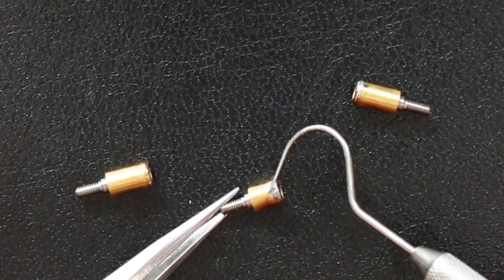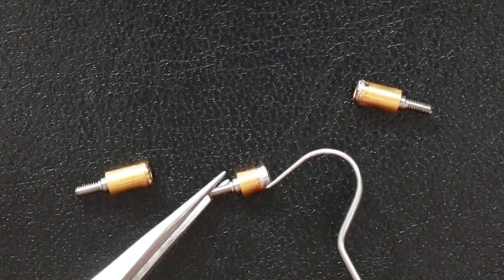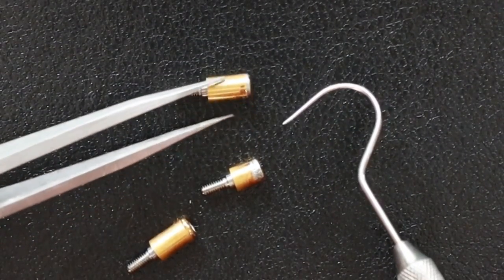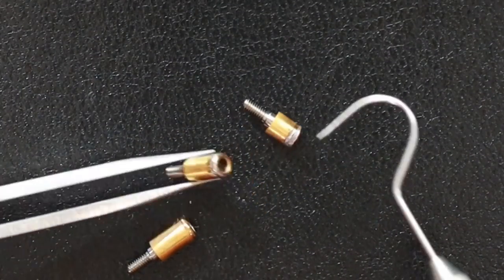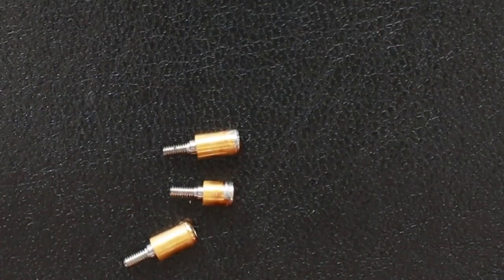When that happens, new snaps won't hold the denture in place anymore, and you will need to have the posts replaced. Here are some implant posts that I had to replace for a patient because they were too worn down. It's easy to tell if they are worn down because the gold color is no longer visible on the post. Worst case scenario, you could even end up damaging the implant itself. If the implant breaks or cracks, it will need to be removed and a new implant placed.